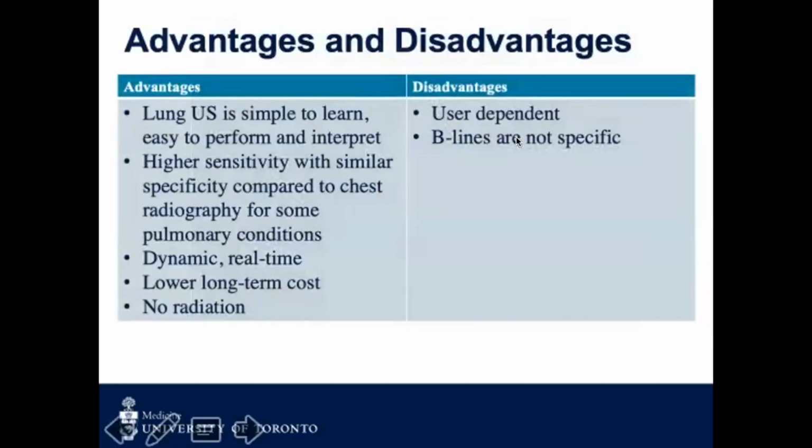So I think I've kind of beat to death the advantages of ultrasound. The only other thing I would like to add is that it is no radiation, and that's important when it comes to our CCU populations or ICU populations who often get scanned, sometimes multiple times a day for several days. It does add up. Also, the utility of lung ultrasound is quite integrated in the pediatric population for this specific reason. The disadvantages, I think, are lower.